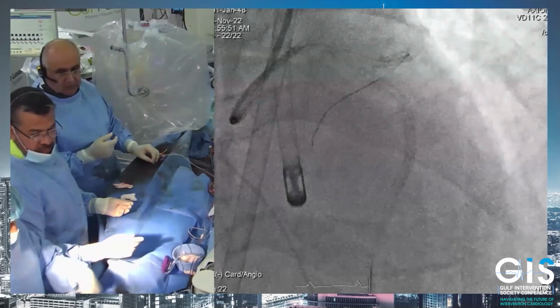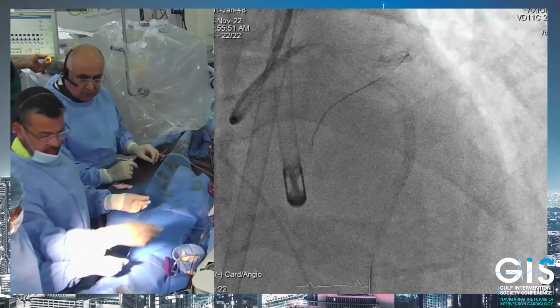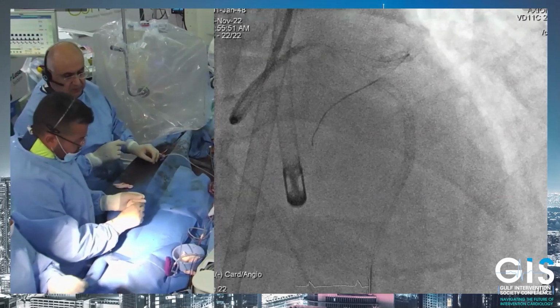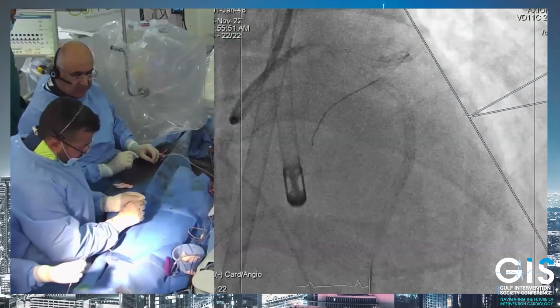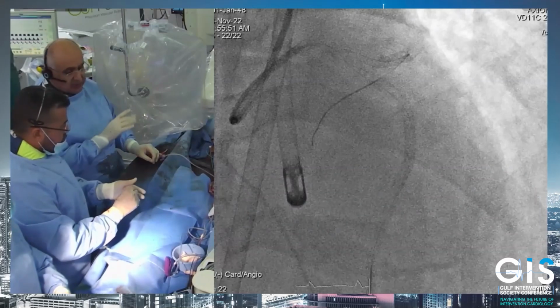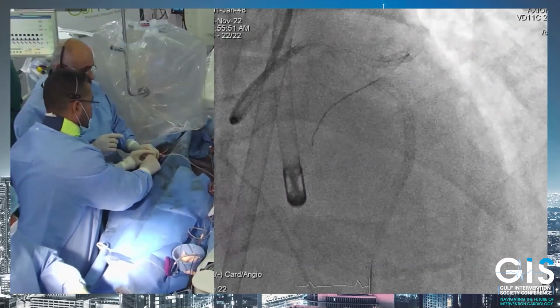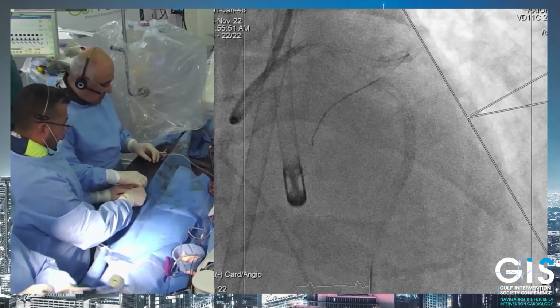So excited to see what the imaging of the left main shows and to help us plan and choose the right strategy. Arif, what was the wire you used? This was Sion. Okay, so normal Sion, standard. What are you going to do now? Balloon first. I was having some challenges to cross that calcified ostium, but luckily it went in.